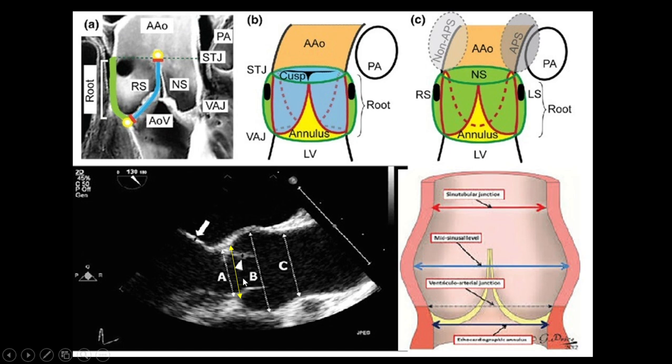Again, we measure at diastole, leading edge or outer to inner. This measurement has not been done correctly at the right moment. Then another one is the same as the aortic root we talked about in the previous slide, and we measure the largest one outer to inner. Again, this one is not right. Outer to inner. This is the aortic root diameter.